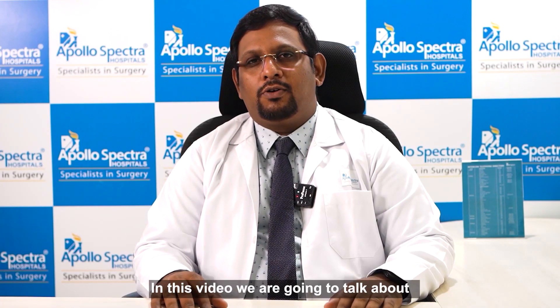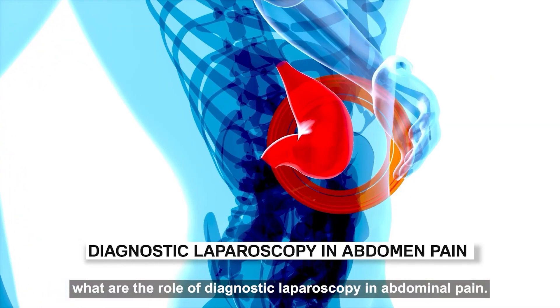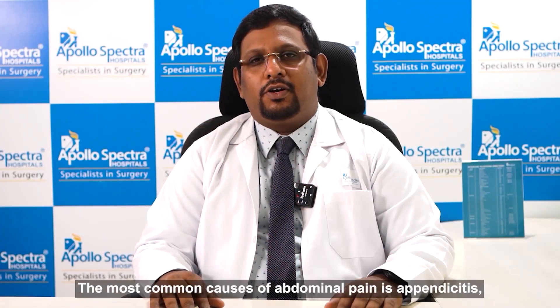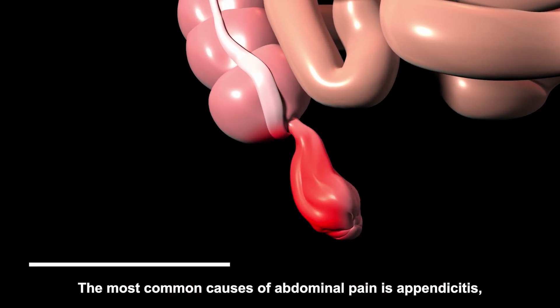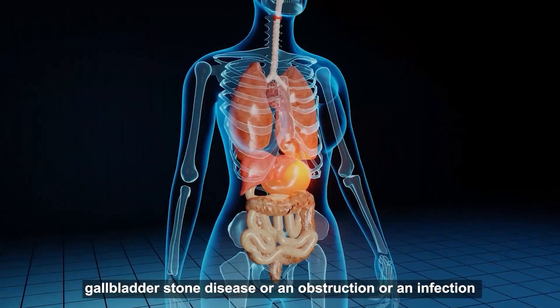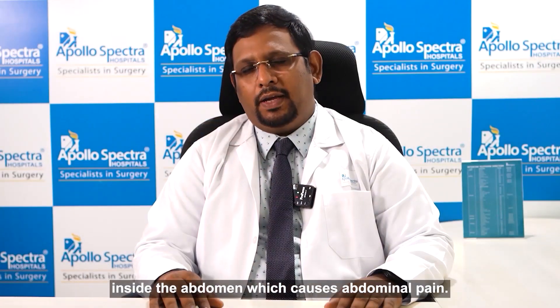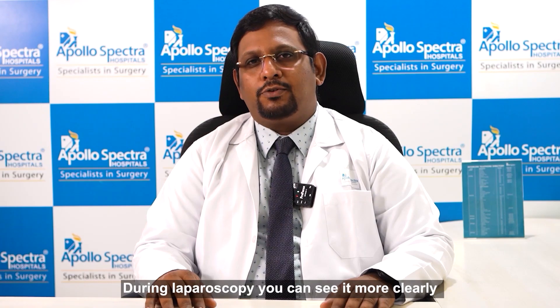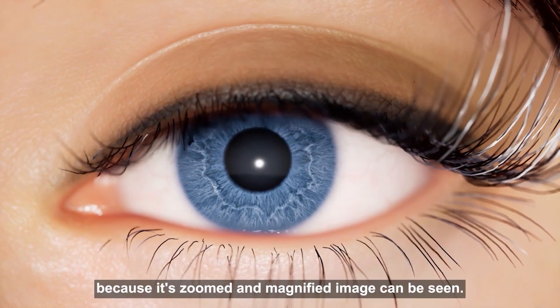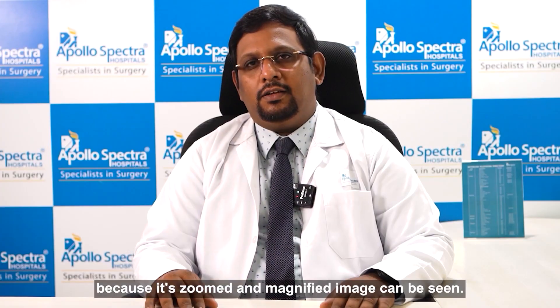In this video, we're going to talk about what is the role of diagnostic laparoscopy in abdominal pain. The most common causes of abdominal pain are appendicitis, gallbladder stone disease, or an obstruction or an infection inside the abdomen. During laparoscopy, you can see it more clearly than with the naked eye because a zoomed and magnified image can be seen.